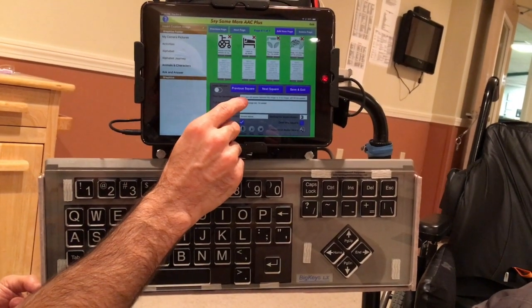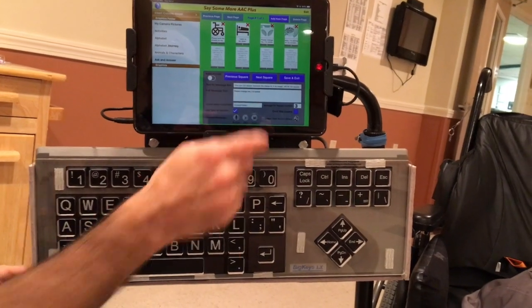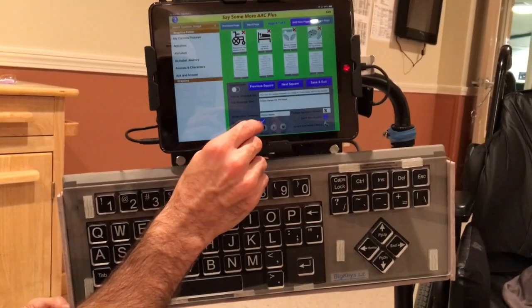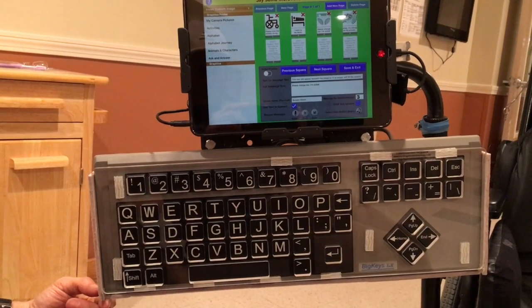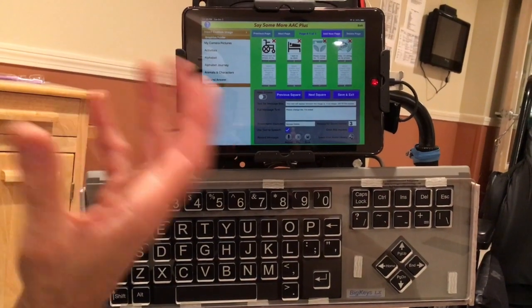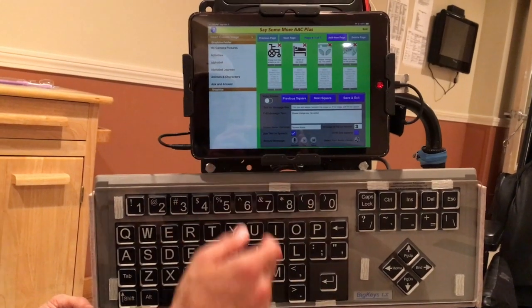And it says right here in this box, please change me, I'm soiled. So you can type that, you can use the keyboard. This is where you type whatever words are going to be spoken. And make sure this checkbox is checked here. It says use text to speech. That checkbox will make sure that it uses the voice to say the novel thing. Alternatively, you could also record an actual recording of a voice. So that's possible, but probably easier just to use the text to speech.